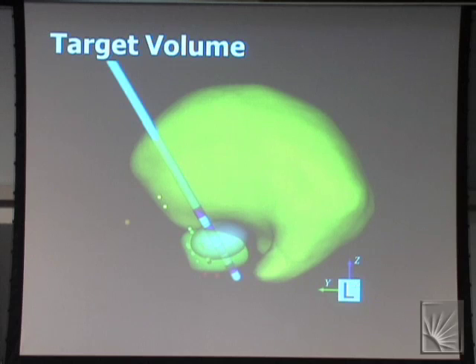So the concept is that you would now put a tablet PC in the hands of this clinician programmer, and now they can visualize, okay, here's where the electrode ended up in that patient, and here's the microelectrode recording data that we saw in that patient, and here's the 3D brain atlas that was fitted to that patient.